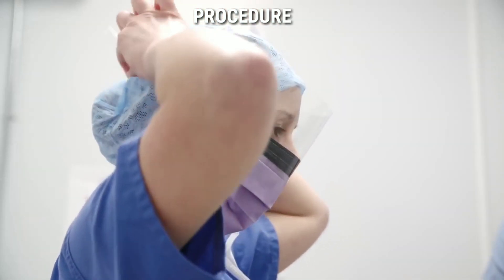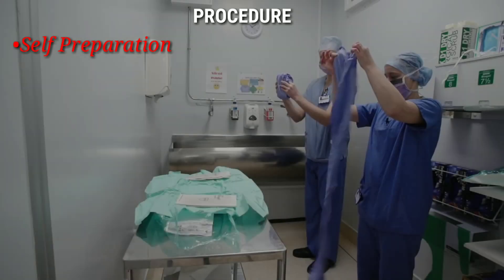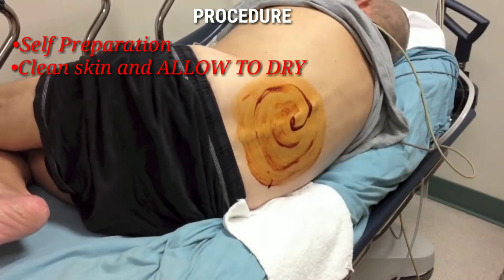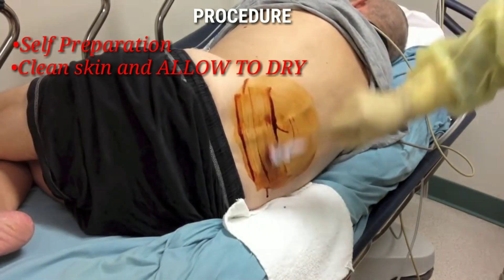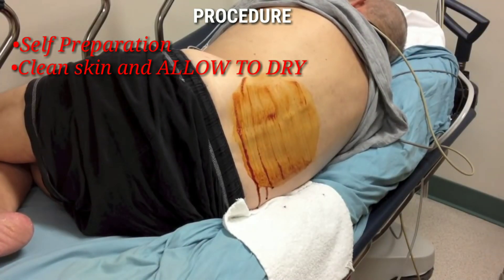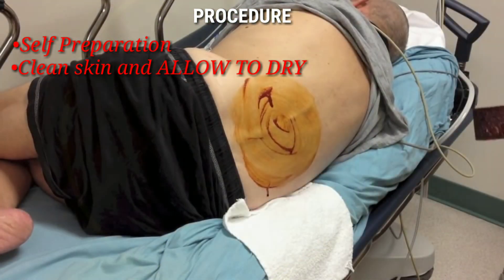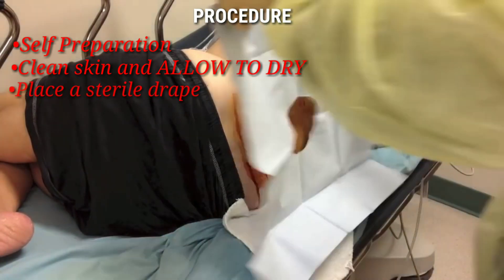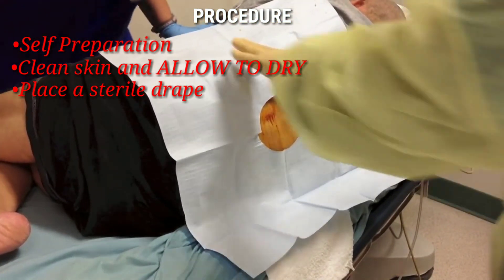Now for the procedure itself: first, put on your gown and gloves and have a mask as well. Clean the skin beginning at the area where you will perform the puncture, then move outward laterally in a concentric motion using betadine and chlorhexidine after cleaning with sterilium. Repeat the sequence of cleaning three times — first with rubbing alcohol or sterilium, then with 10% povidone-iodine or betadine — then place a drape to create a sterile field.